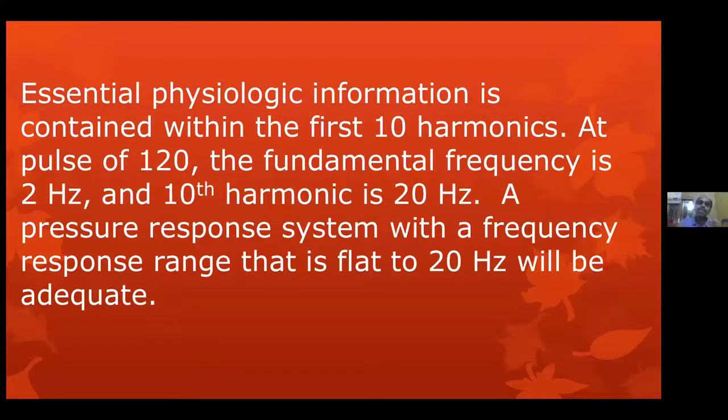In another patient, there is no pressure recovery and it is 115, it is an 85 millimeter gradient, not much of a difference because the distal pressure is so low. So the term pressure recovery does not make sense in pulmonary stenosis. It makes sense in the aorta because aortic pressure is high.